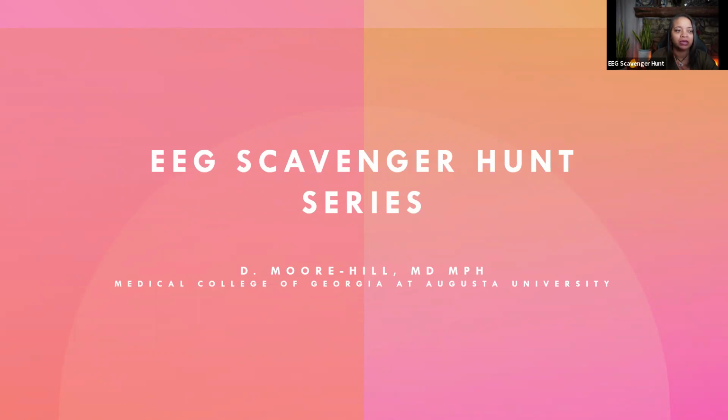Okay, so you're going to hear some terminology throughout the pattern recognition series that you are not familiar with, but you have to start saying the words. If you say them enough and see enough EEGs, then this starts to become second nature to you, as it is to many of us who've been doing this for many years. Again, this series is going to be called the EEG Scavenger Hunt Series, but this first video is just an introduction to start the conversation for new readers.